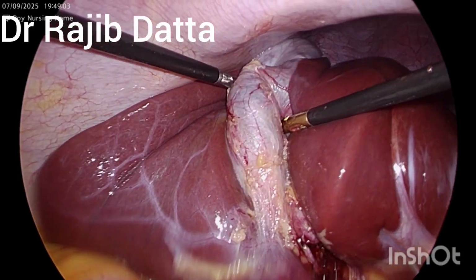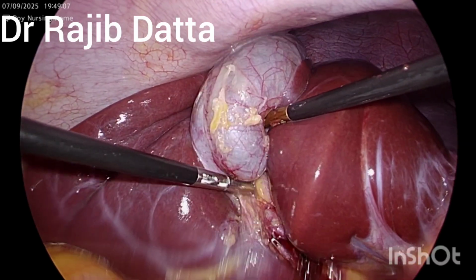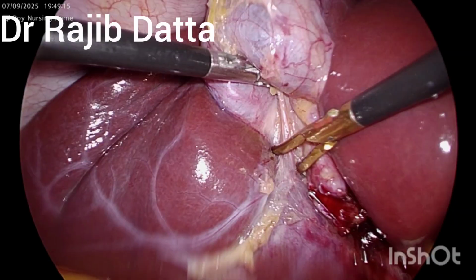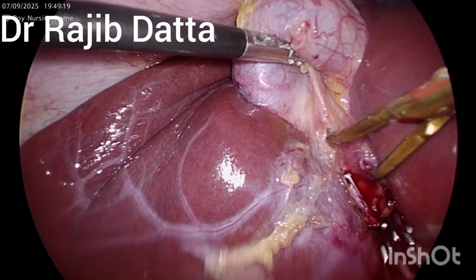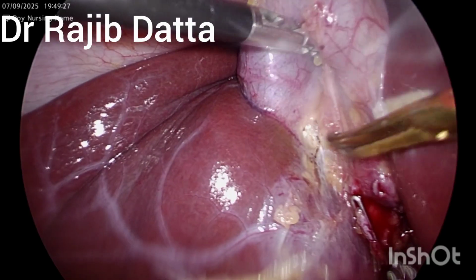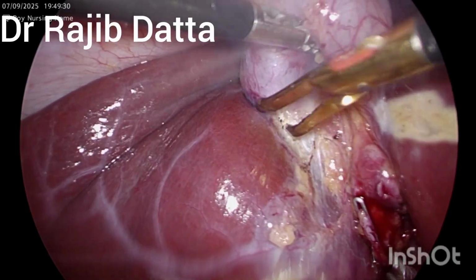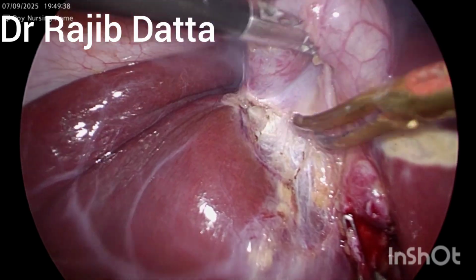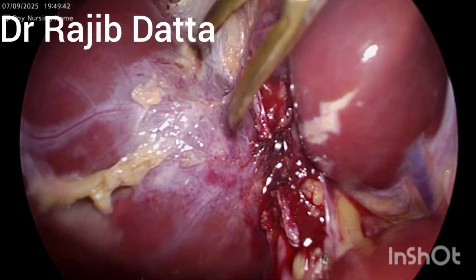Now again the bipolar shearer is in, and I bipolarize the tissue separating from the liver bed, as well as the cystic duct distal stump and cystic artery distal stump, with the help of this bipolar shearer.